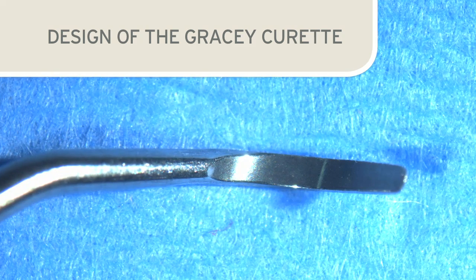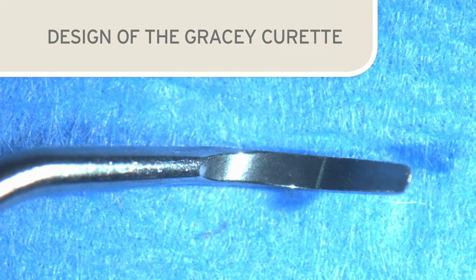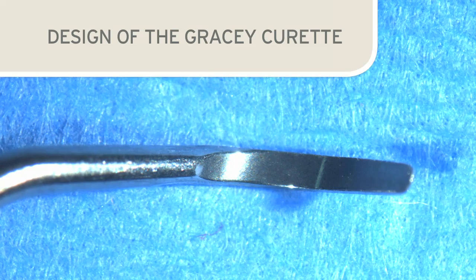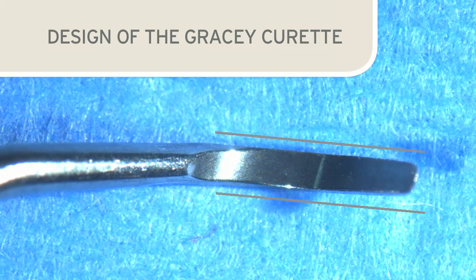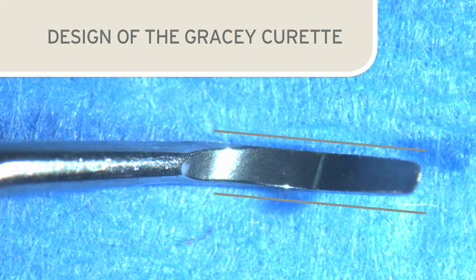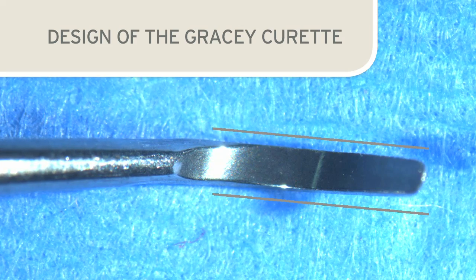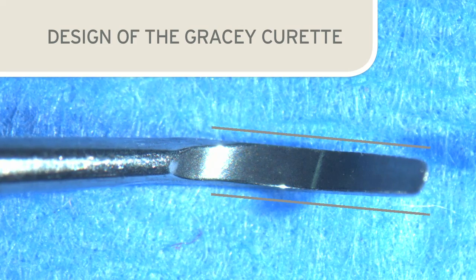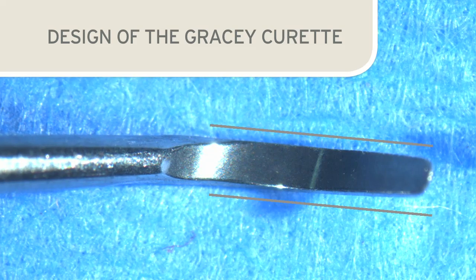It is important to note that the lower cutting edge of a Gracie curette can give the illusion that the blade is curved to one side. This is not correct. Close inspection shows that the lower cutting edge is parallel to the non-functional edge of the Gracie — it is just lower due to the 70 degree angle of the blade. This is important to remember in order to retain the original blade design when sharpening.